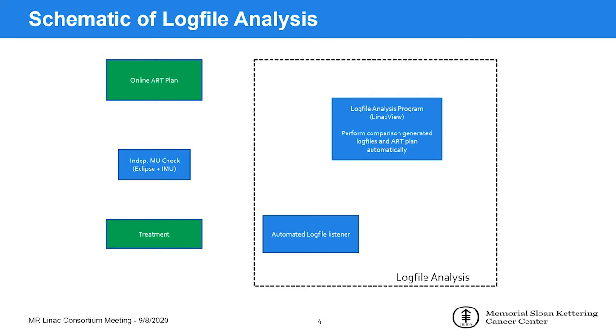Here's the schematic of the log file analysis. On the left, we have the simplified version of the daily adaptation workflow. We have the online adaptive planning step, and the independent MU engine, IMU, which adapts a commercial treatment planning system for this purpose. If you're interested in the details, a little commercial here: a colleague of mine, Jay Yang, will present his work at 9:50 on Wednesday. On the right is the log file analysis engine. It has two components, the automatic log file listener and the log file analysis engine, Linac View. Let me walk you through this process.